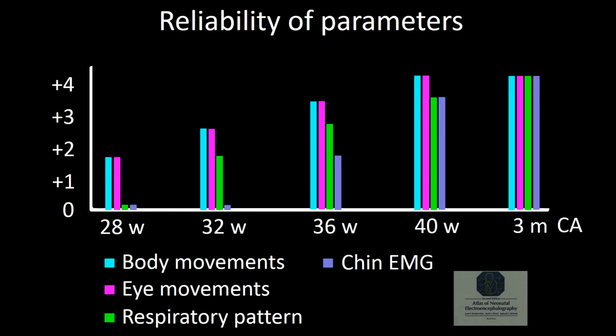As you can see in this figure, published in the same book from which the data I just previously gave you was collected, it has a slightly different bend to what we have just mentioned. In the y-axis of this figure, the number represents the reliability, 4 being most reliable.